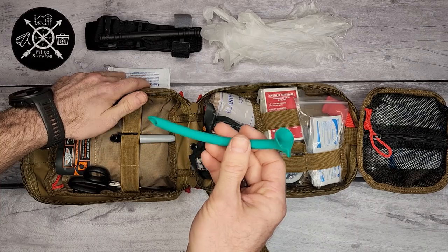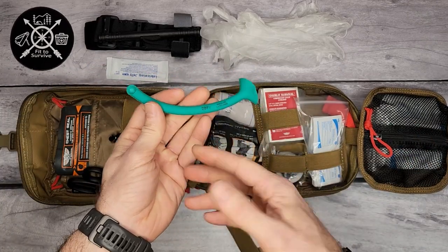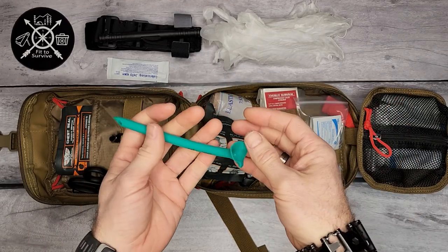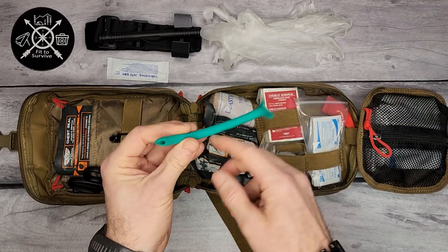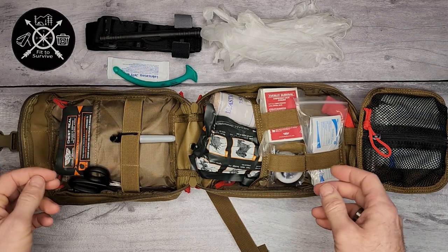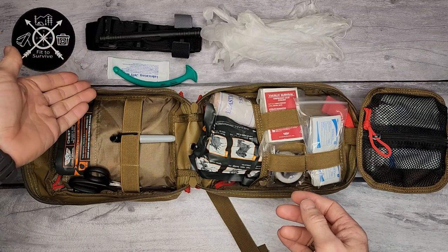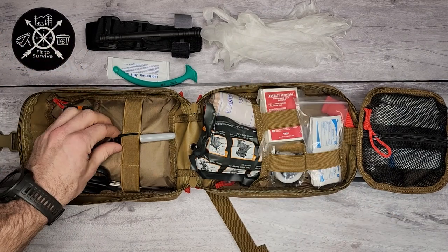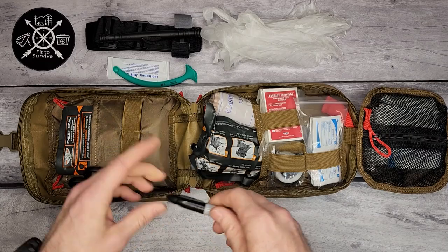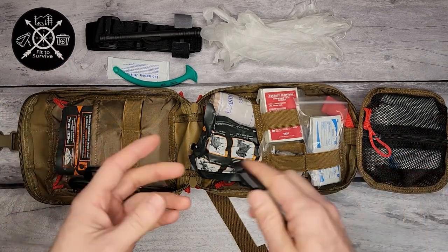Usually these come in a bunch of different sizes depending on the size of the person you're treating, but this is just a single size. If you don't have any qualification to use it, you can actually hurt somebody trying to use it without knowing how. I can't say it enough — be sure to get training on all of your first aid and emergency gear.